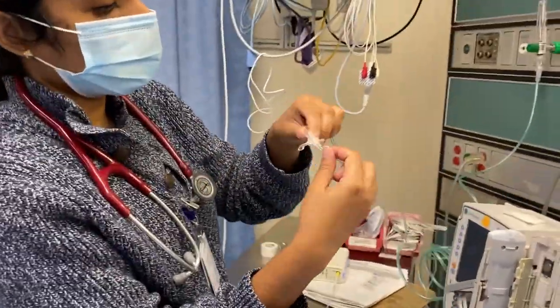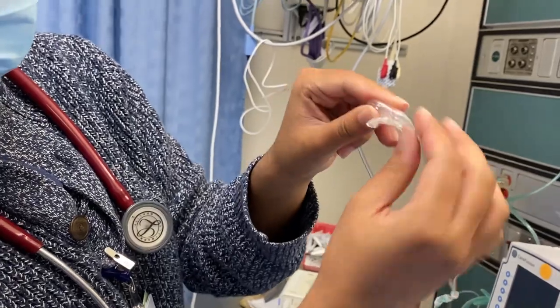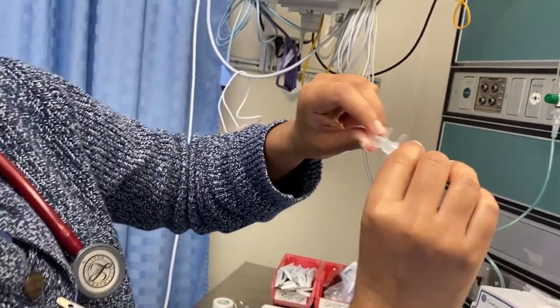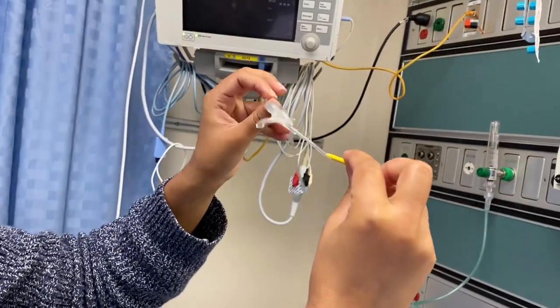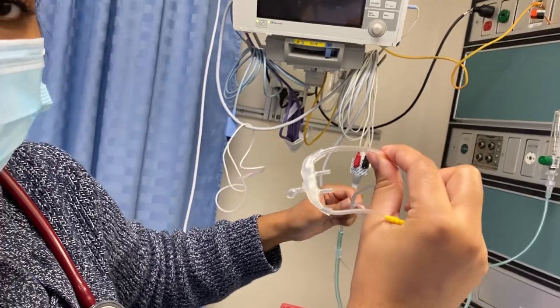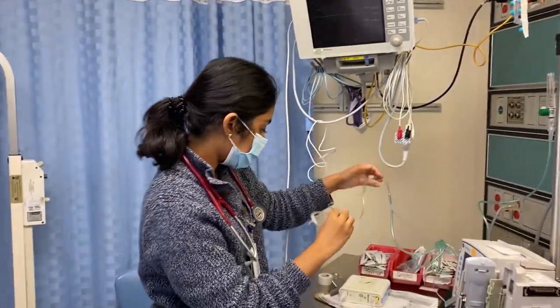Okay. And then once all of this is attached, this little piece, if I can find it... there it is. So the prongs go in, or this is your little piece that goes with the hole facing the mouth. And you put it on like a nasal cannula where these go behind the ears, and you can tighten it and fasten it on the back. Okay. And that's it. All right. Thank you.